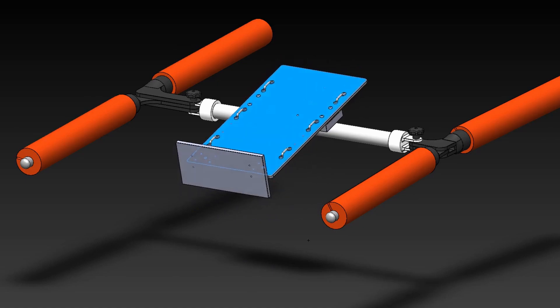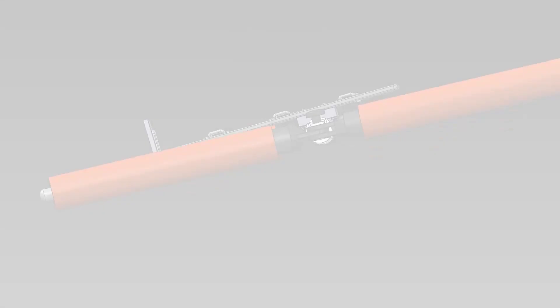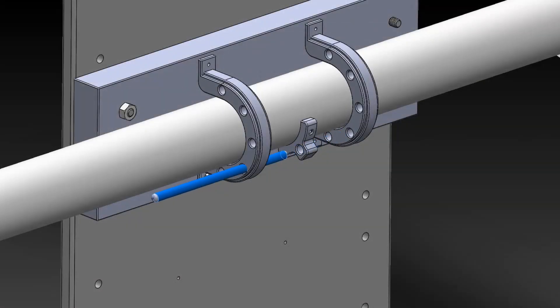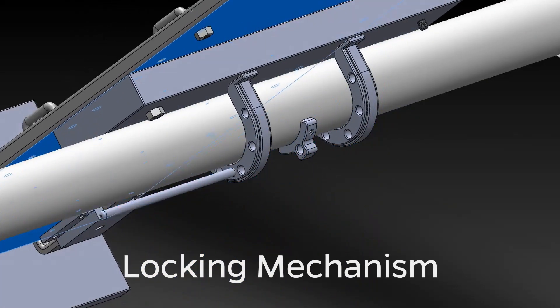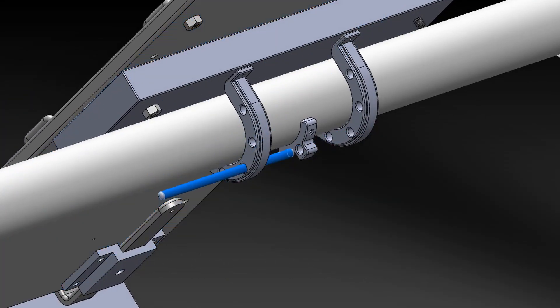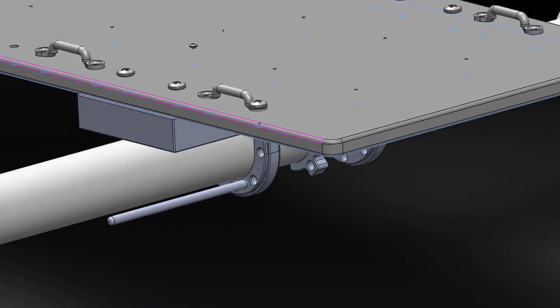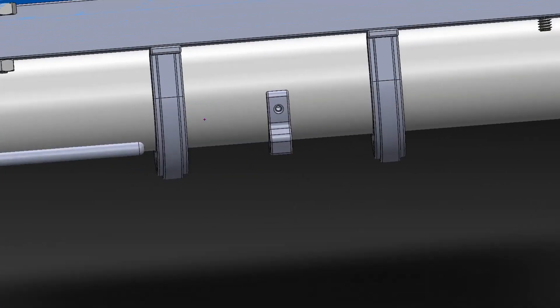This short video demonstrates the rotation of the ventral support board. In a real setting, the board would be rotated to a vertical position to load the patient. When a therapy session is conducted, the board can be rotated back to the horizontal position. To achieve this, a special locking mechanism is used to secure the board at various angles.